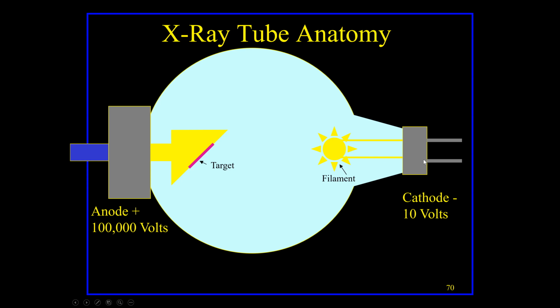When we turn the electricity on, that filament gets really hot physically, and it starts to glow. When it reaches a certain temperature, it will actually boil off electrons that form an electron cloud that hangs around the filament. Then there's this great big glass tube, and inside the glass tube is literally nothing. It's not even air in there. It's an evacuated tube. They've sucked out all of the air, and the tube is in a vacuum. So the electrons are made in this filament when it's turned on.